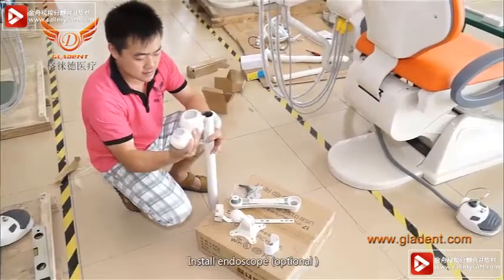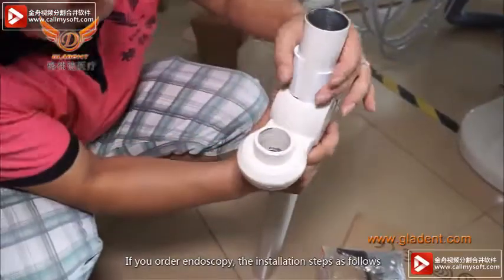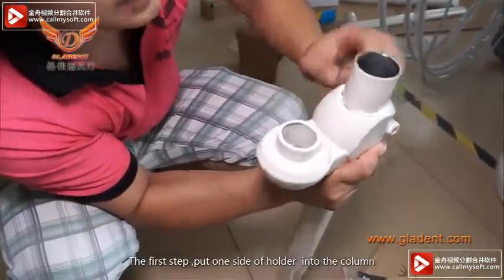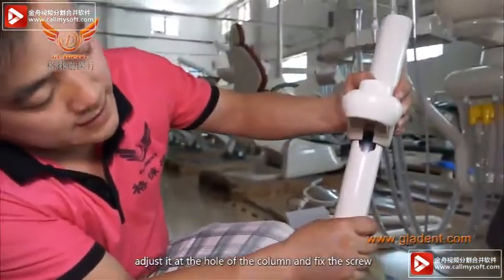Install endoscope — optional. If you ordered an endoscope, the installation steps are as follows. The first step: put one side of the holder into the column, adjust it at the hole of the column, and fix the screw. The second step: install the lamp arm on the dental unit.